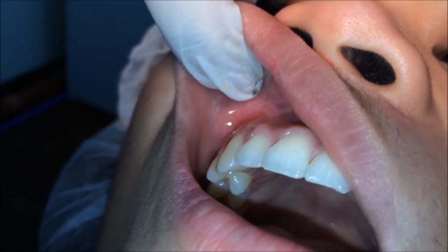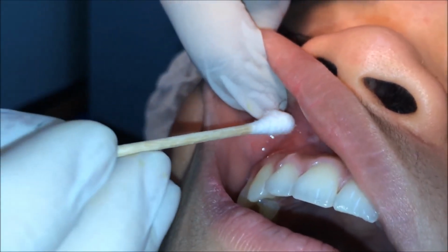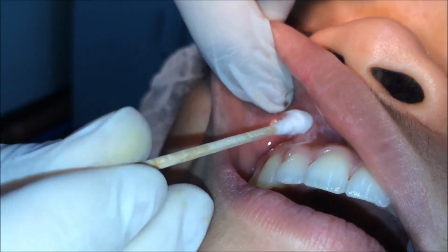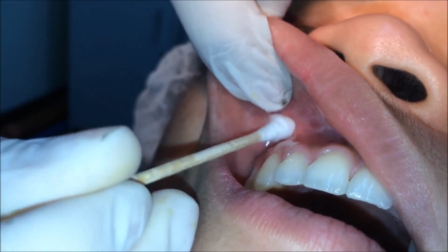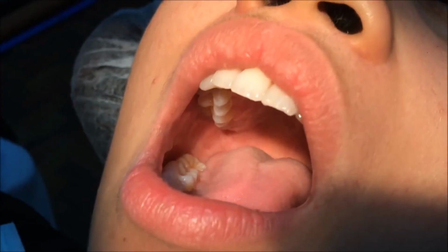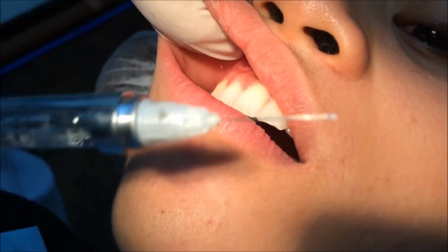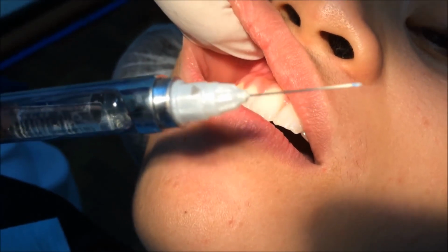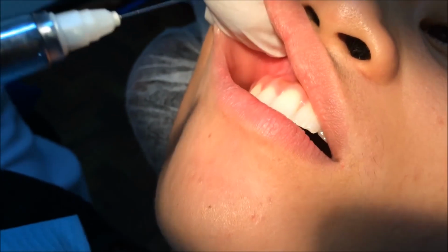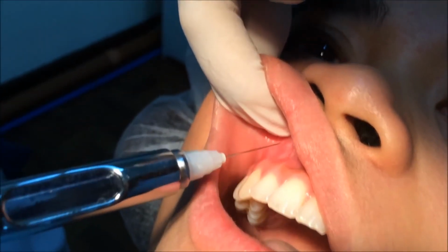For the next topical, we are about to apply the anesthetic. Then we wait for 1 minute. We orient the needle so the bevel faces the bone. As you can see, there is a black marker which indicates where the bevel is located for easier identification. We place this and then orient the needle so it faces the bone here.